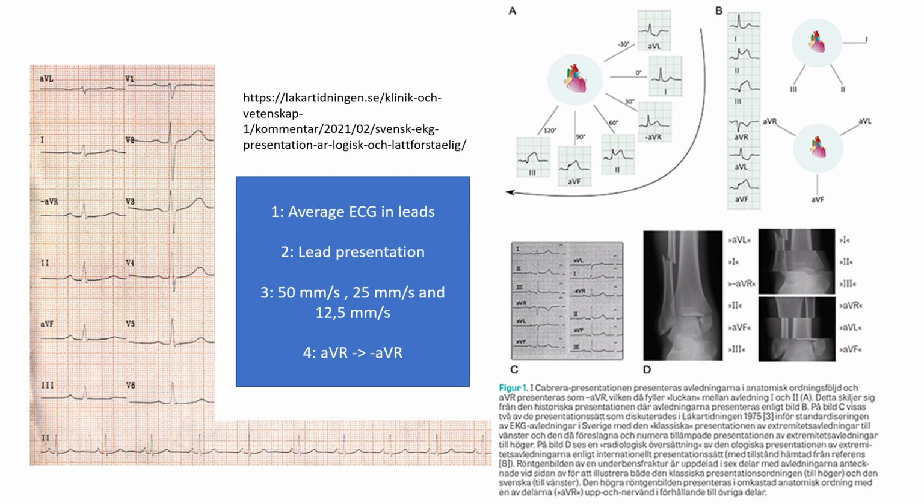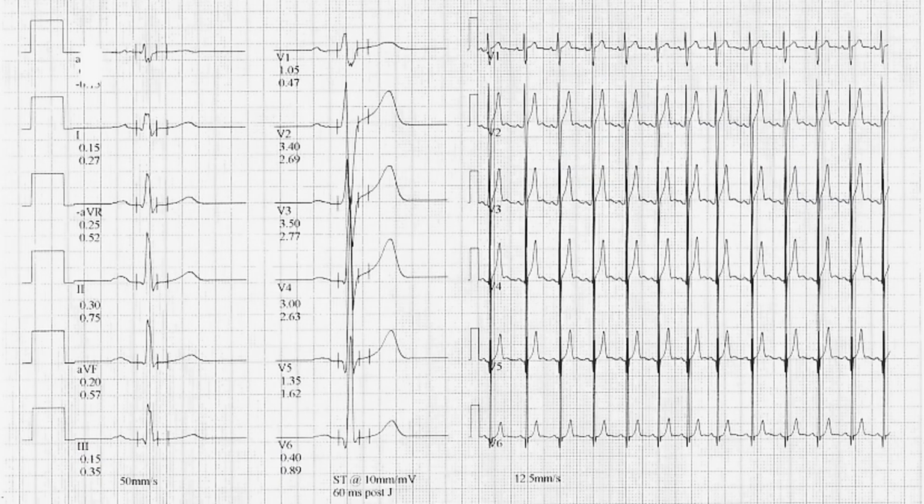Just a fun thing. I don't think it's totally appropriate, but they kind of argue that if you have an X-ray that you would build like this, then the X-ray would look like this. So it's much more logical to have it from top to bottom. I think it's funny, but all right.